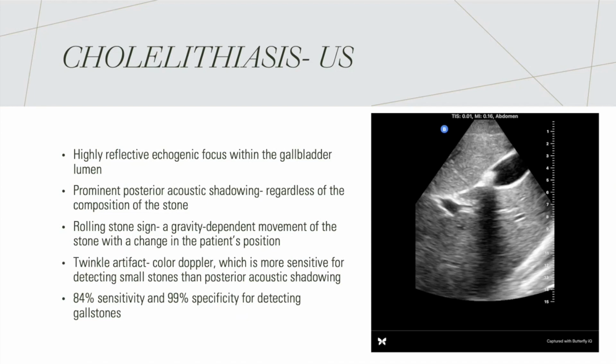So I'll go through this image here. First, it's important to go through our orientation. So right here, it looks like we're using a phased array probe. As well, we're in the medical orientation as our marker is to the left of the screen.